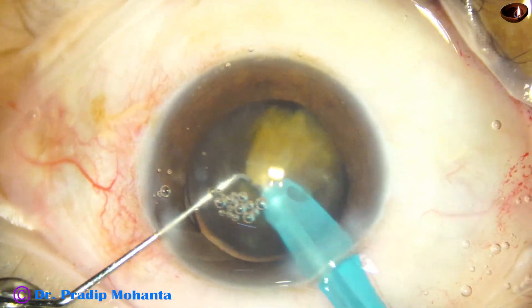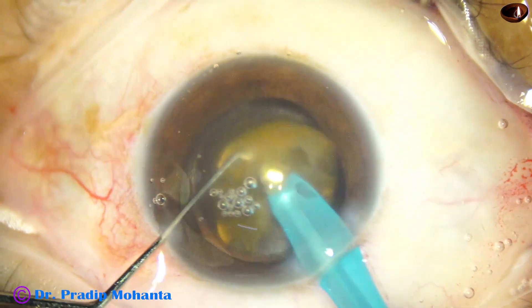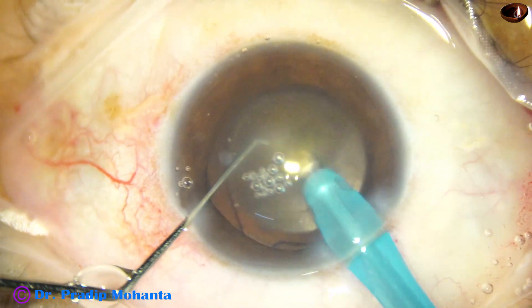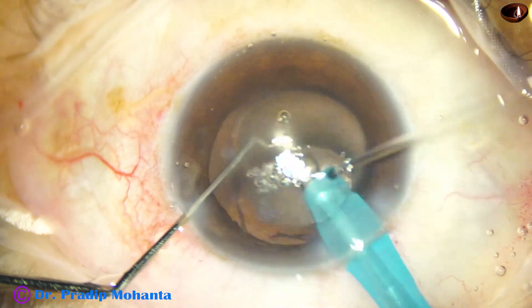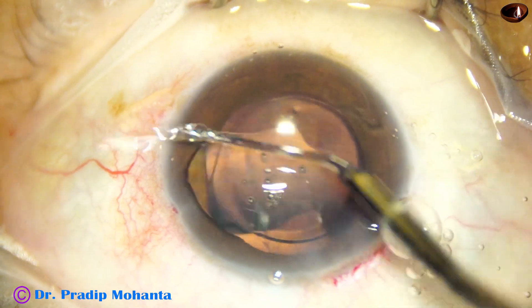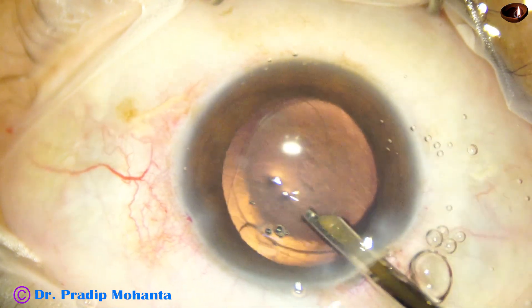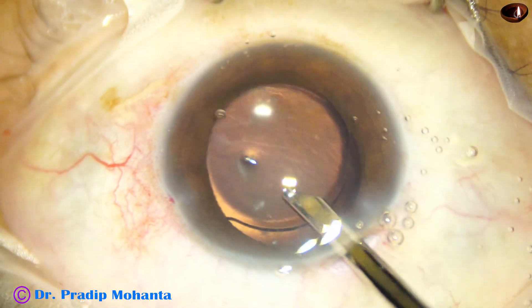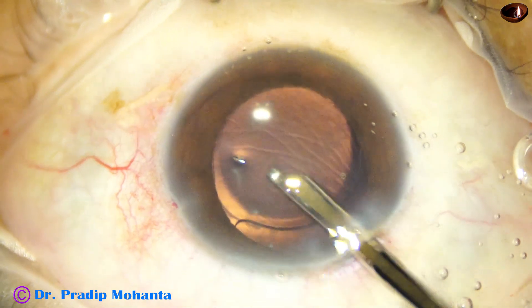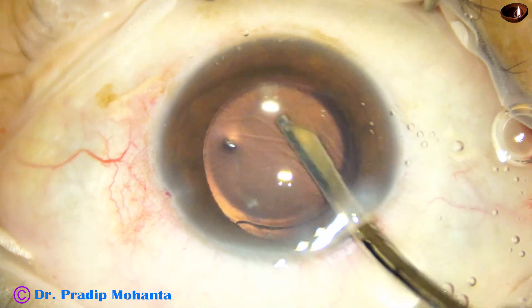Always careful to work at the iris plane, far away from the corneal endothelium, remaining at the central part of the anterior chamber. The nucleus has been managed. I use the Simcoe cannula to check for cortex, but there is no cortex in this case — all the cortex has been liquefied and converted into a milky fluid. This is a typical hypermature morgagnian cataract.